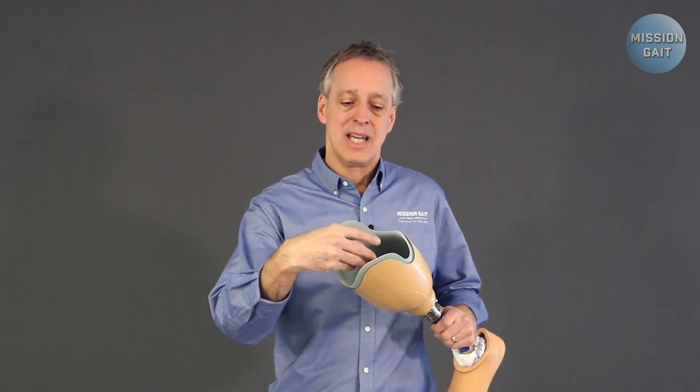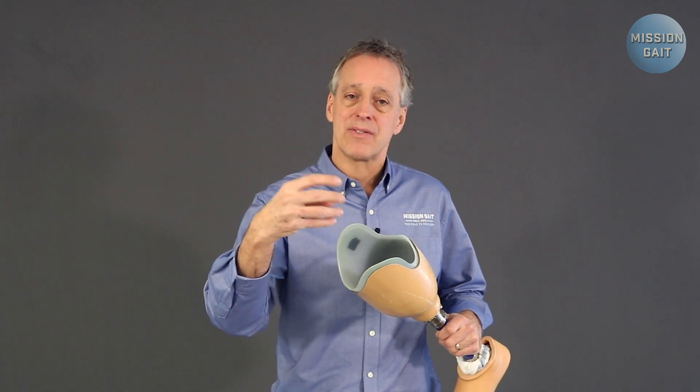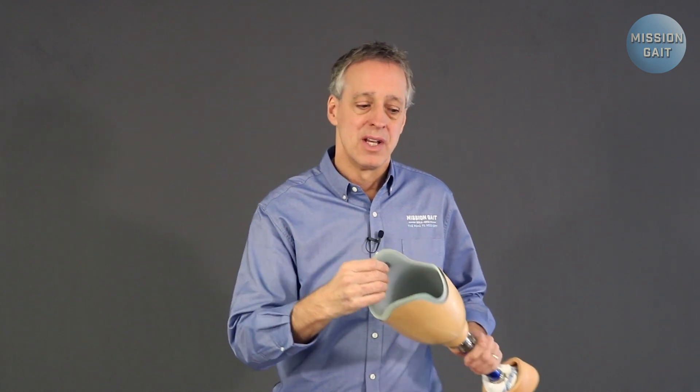The limb is not going to be the same size. As that occurs, something's got to fill the void between the two. On a given day, someone may have eaten too much salt the night before, swell up some, and have to take some socks off. The human body is a dynamic organic machine that's changing every day, and socks are the only way you can adapt the fit of a fixed socket to the patient on that given day.